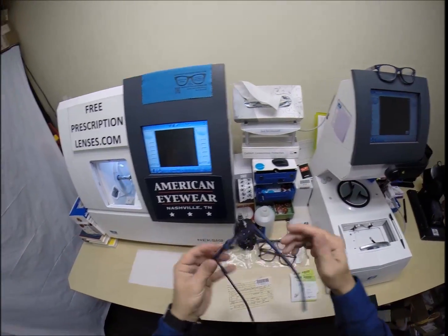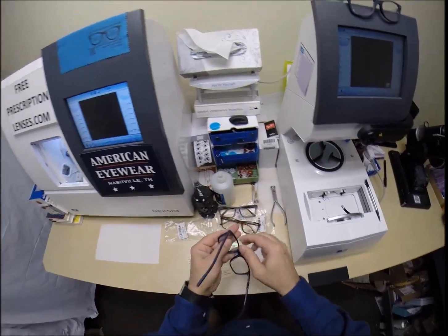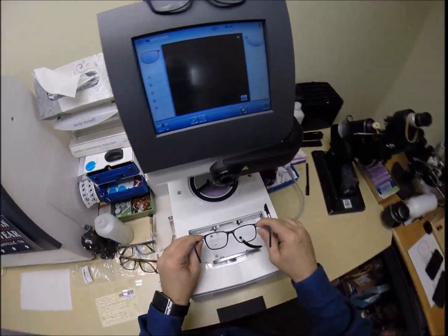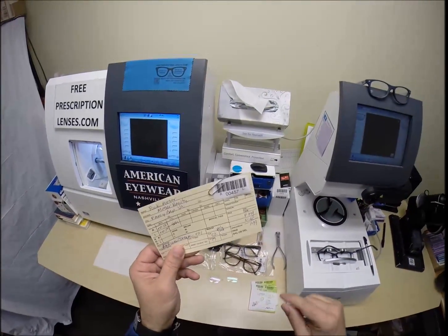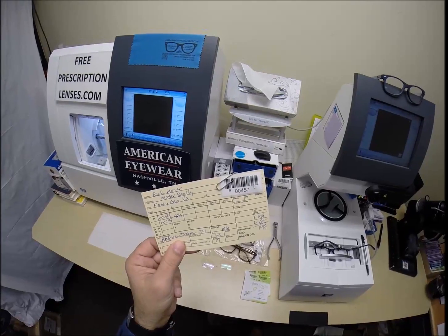So let's begin. I'm going to take out the original demo lenses and place your frame into the tracing element of my blocker. Oops, wait. You are Secret Agent 457.